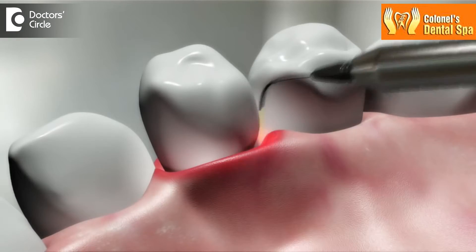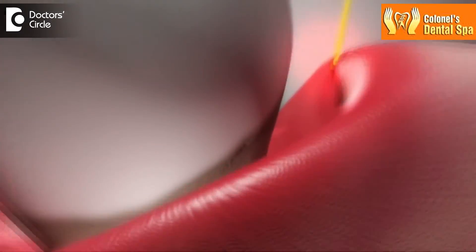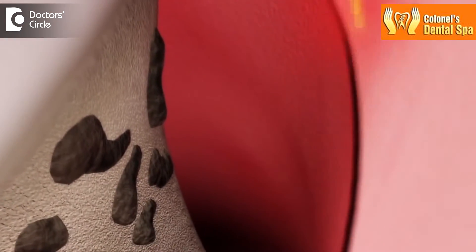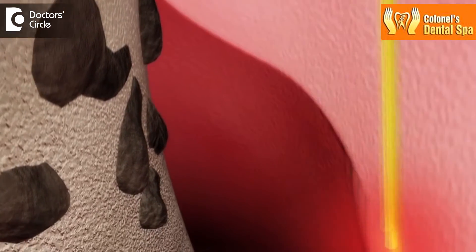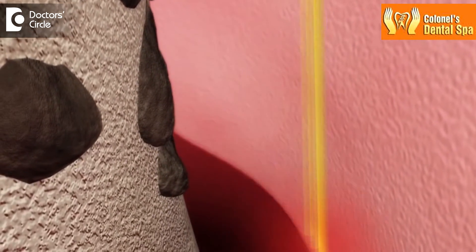To treat gum diseases, the diseased soft tissue has to be meticulously removed. In the process, the laser is very effective. The laser energy is emitted as long as the laser is activated. This procedure requires the constant tissue interaction which we do during laser surgeries.